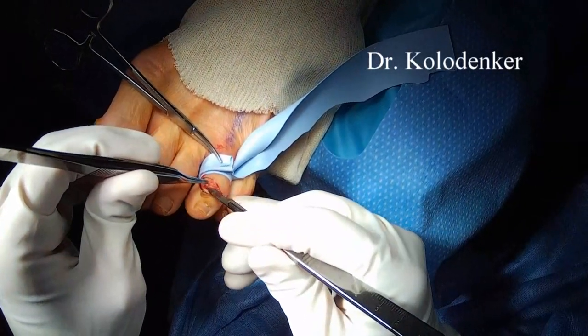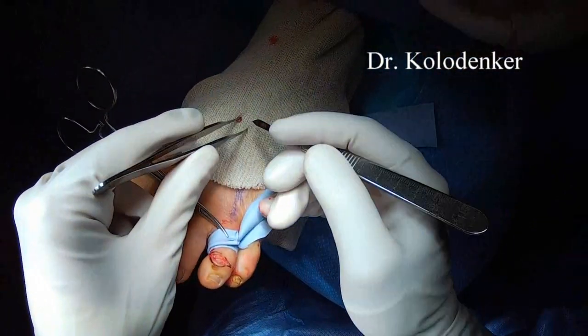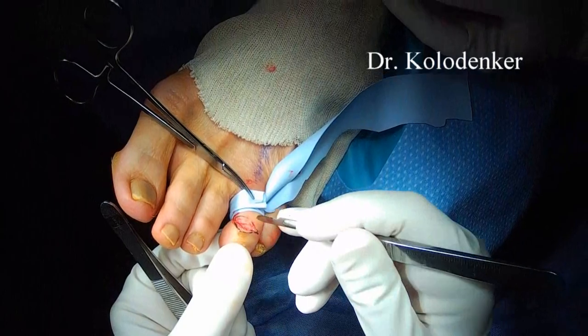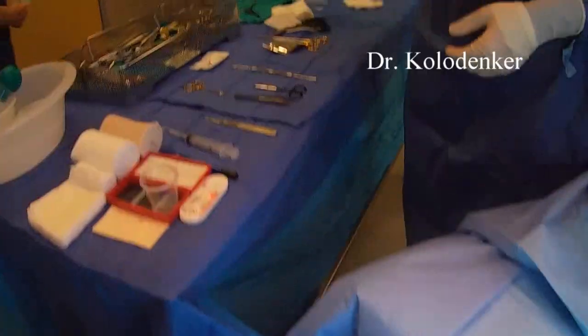You'll go all the way down to the joint — you can ronger a little bit, you can cauterize. Anything to help create scar tissue at that joint level is really important.